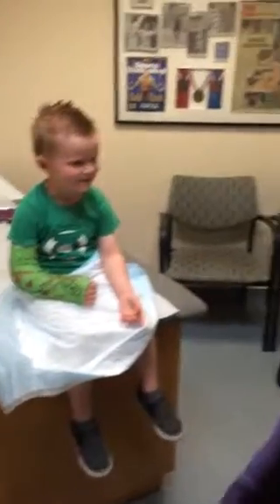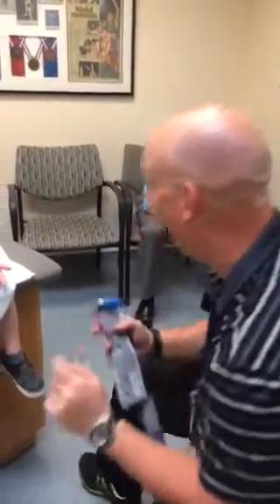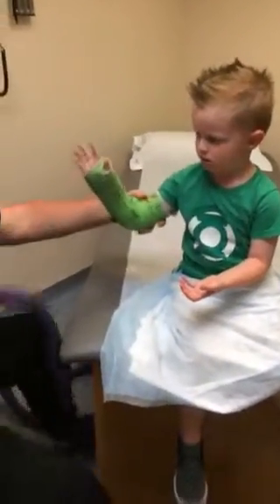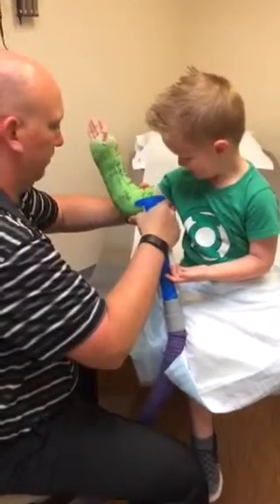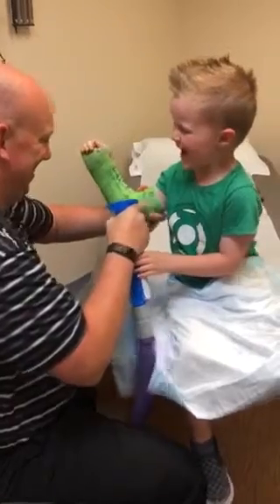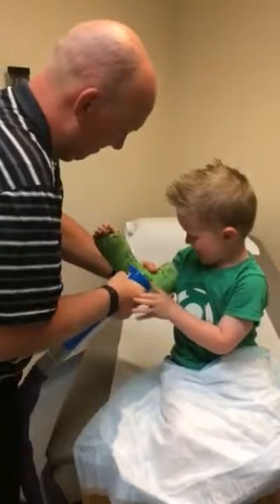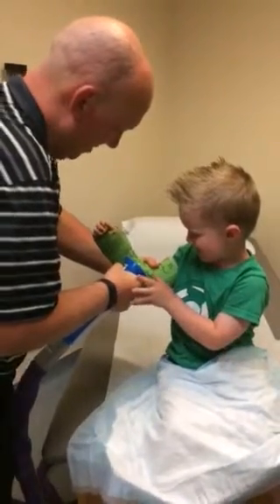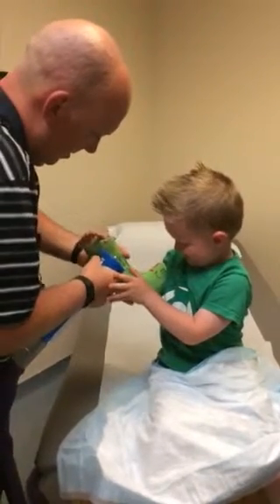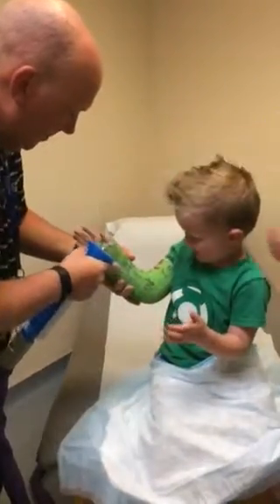Okay, you ready for my cool trick? Don't do this at home. It doesn't cut. I'm going to do your upper arm part right. Try not to use your left arm — put your left arm still down. Take the fingers out straight on you, straight fingers out your arm. There you go, there you go, buddy.